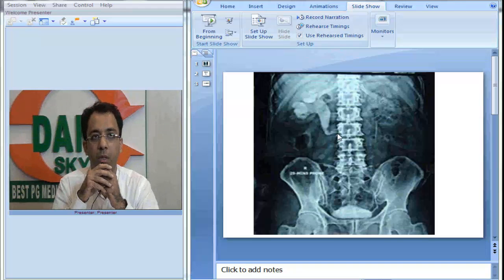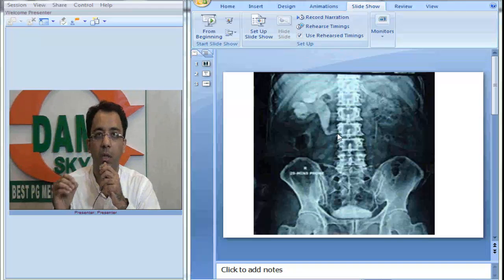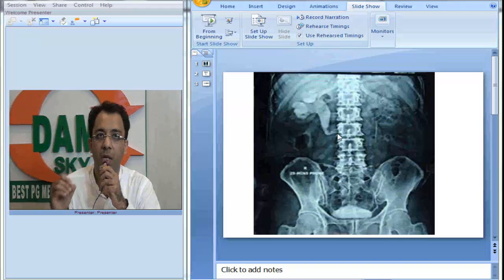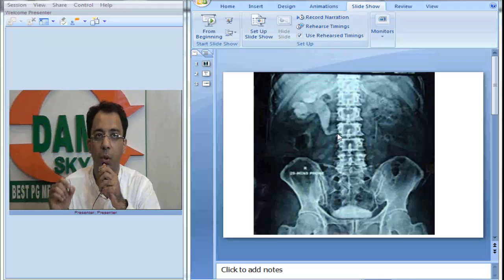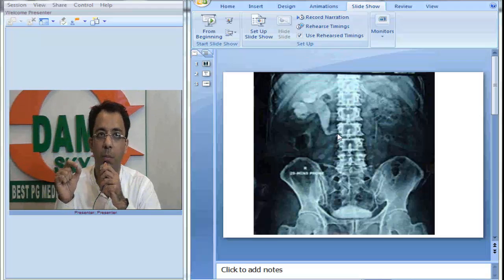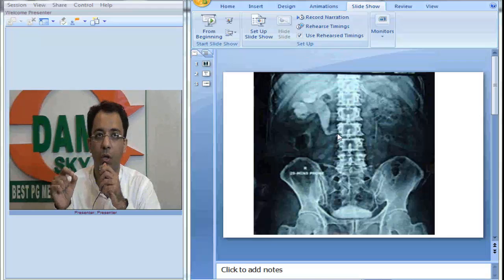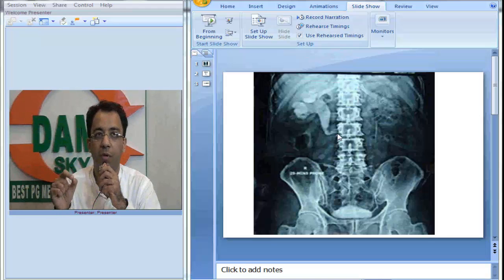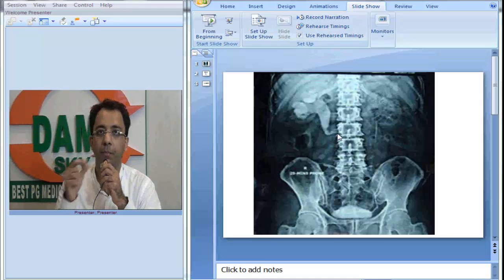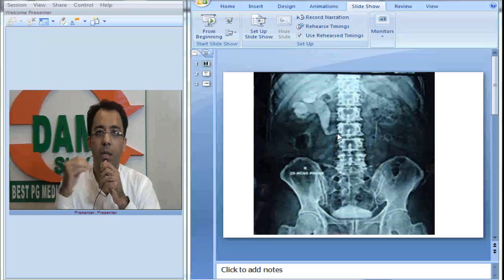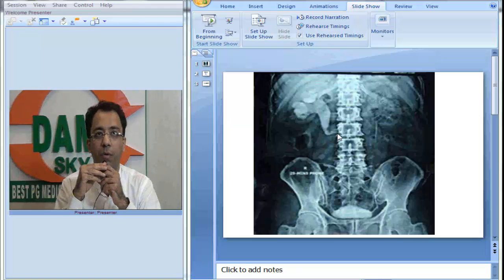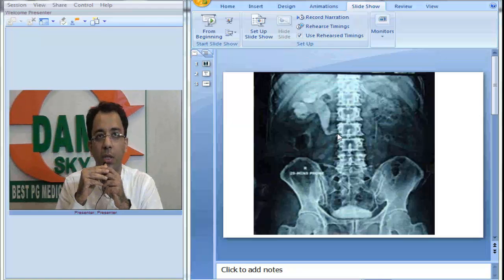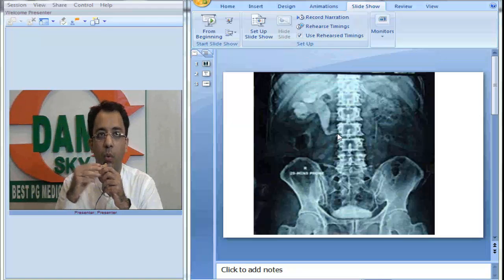Let me repeat: we see right-sided hydro-ureteronephrosis. There is proximal hydro-ureteronephrosis with medial deviation of the ureter at the level of L3. This is a classical description of a condition called retrocaval ureter, which is also called circumcaval ureter.